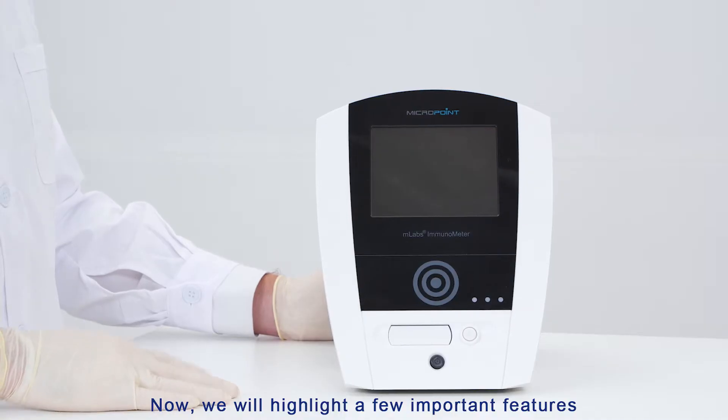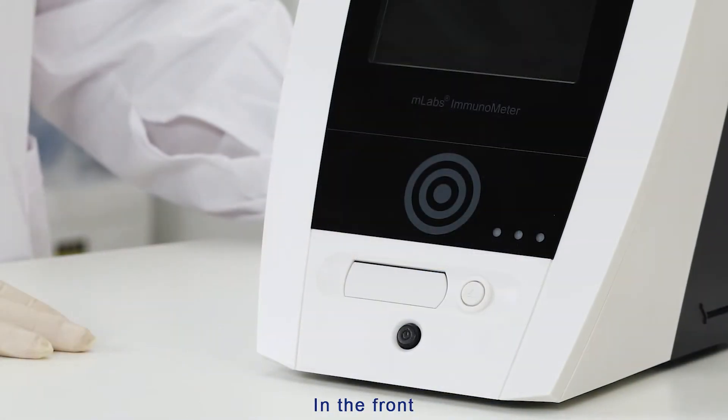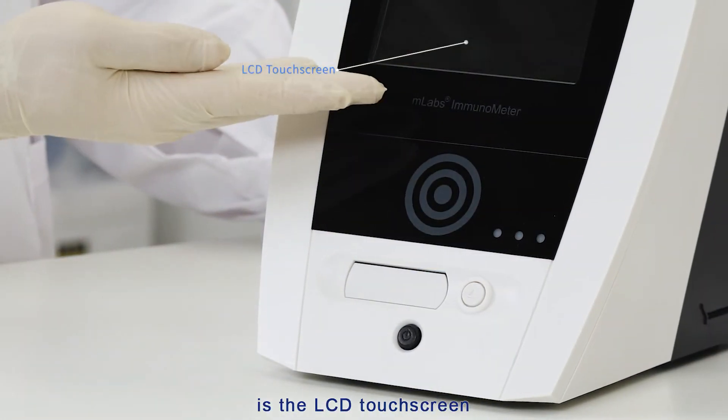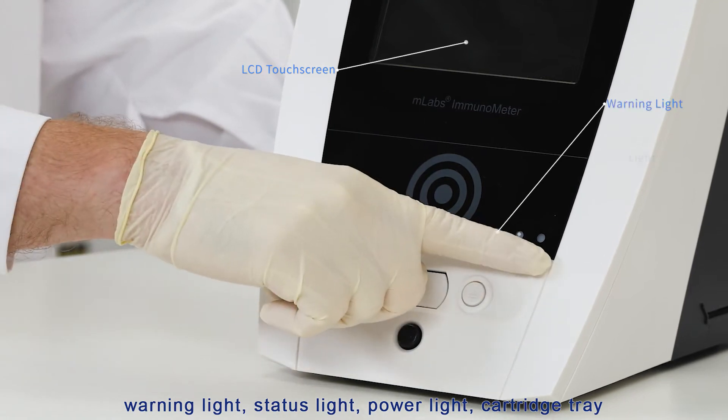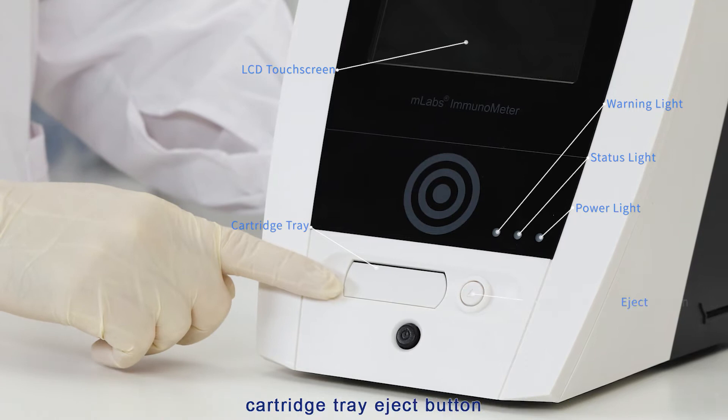We will now highlight a few important features on the M-Labs Immunometer. On the front is the LCD touchscreen, warning light, status light, power light, cartridge tray, cartridge tray eject button, and power button.